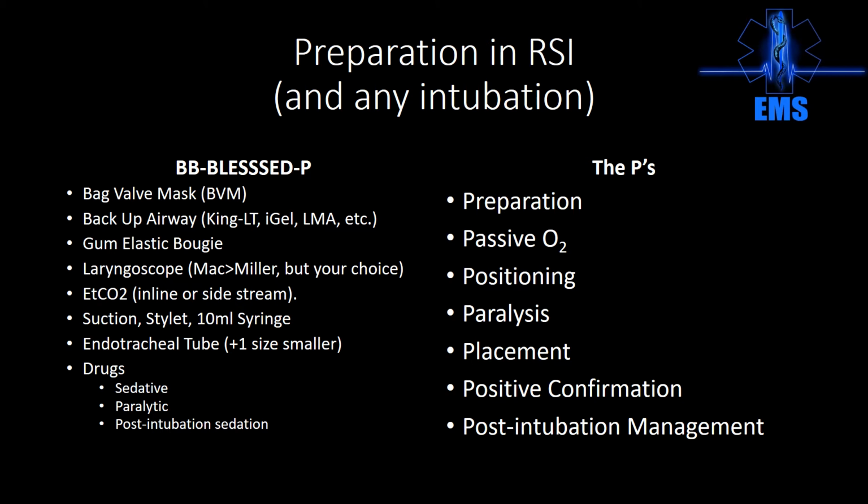The next thing you want to do is throw some passive oxygenation on the patient. This is a nasal cannula, and I've heard people cite 15 liters a minute. That's not enough. You need to turn this thing up till the valve stops. Ideally, you're in the ambulance. This is the main O2, and you turn the valve all the way to the right until it can no longer go, and you can hear it. When I intubate patients, and the corpsman asks me what I want the oxygen set at, I just tell them I want to be able to hear it from the doctor's station. And when I hear the hissing, I know the patient's getting enough oxygen.